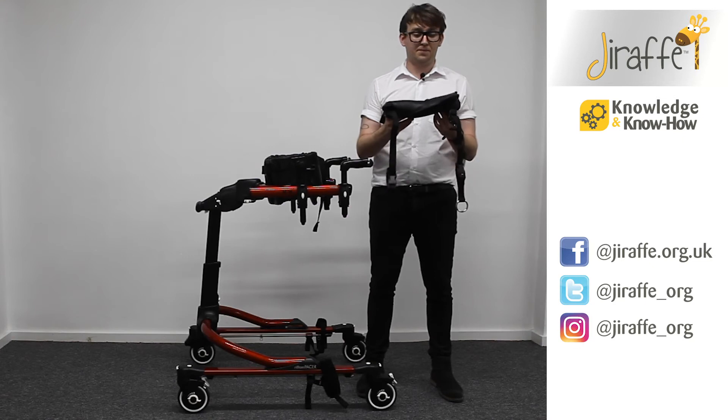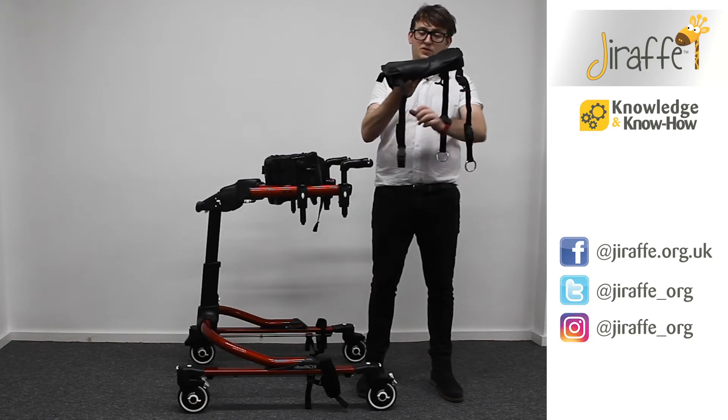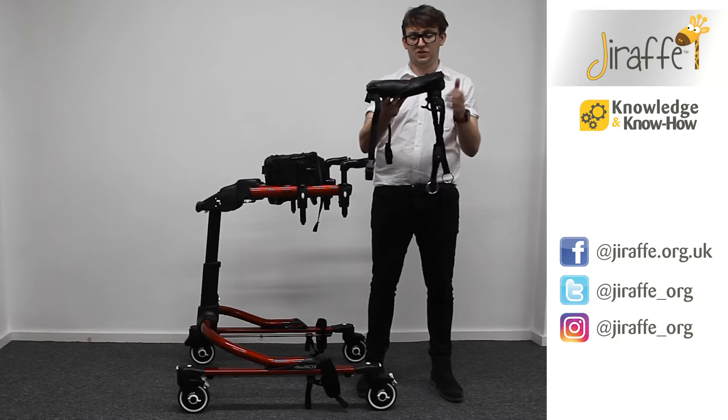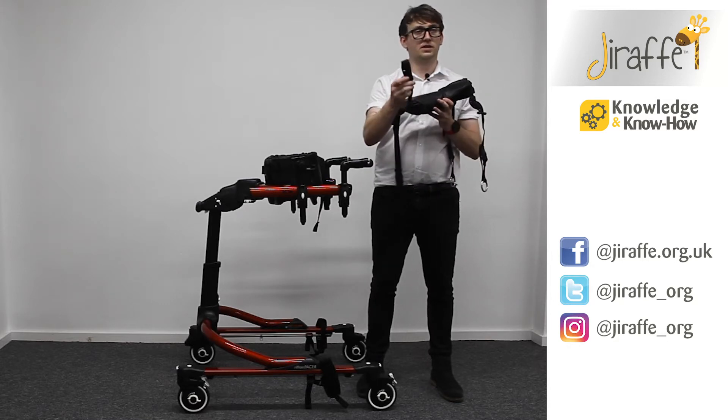We're now going to look to fit the hip positioner itself. As you can see, we have four separate straps. Two of the straps have a metal hoop to them — those are the posterior side of the hip positioner — and then the front two have simply got clips in place.